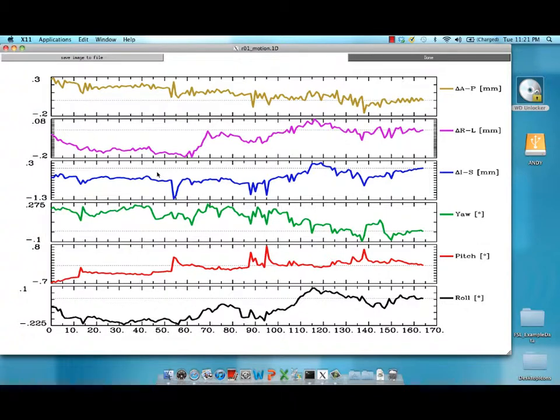But if you see any spikes here, that should alert you that there might have been a huge motion spike in one of those time points. And this might need to be accounted for or censored out when you calculate your general linear model.